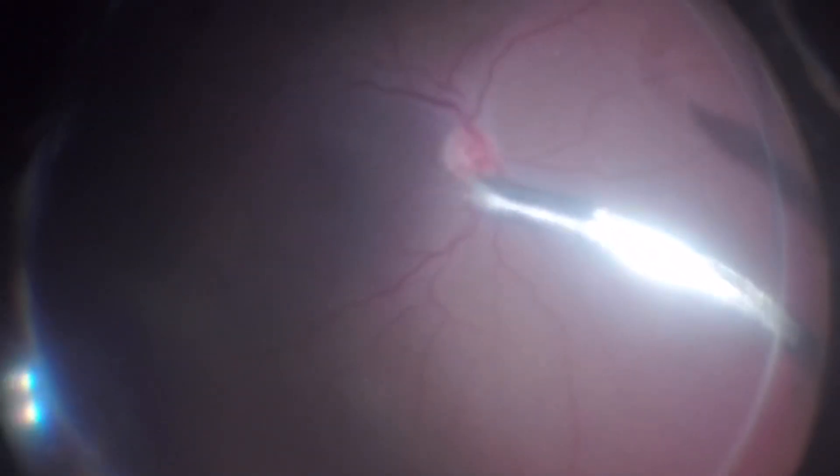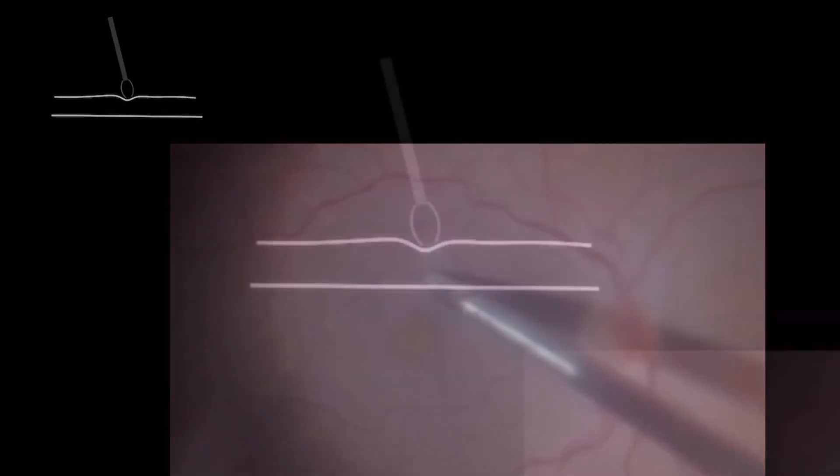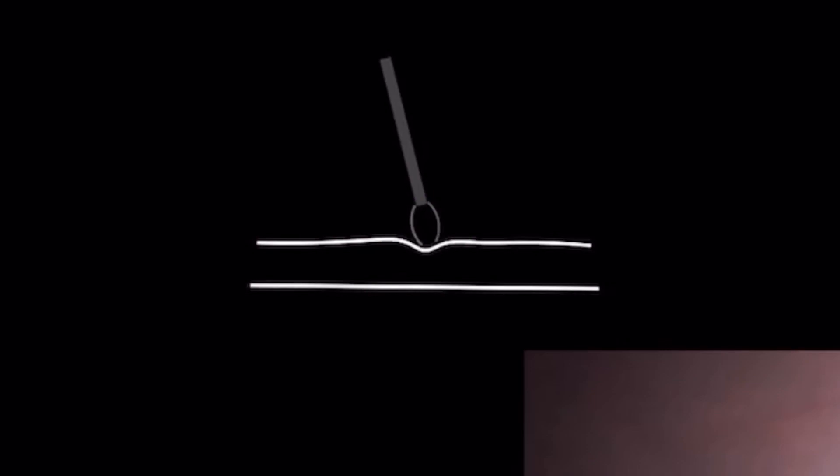First of all, it's important to pay attention to your forceps tip and respect the correct position to ensure that both tines touch the ILM simultaneously. Don't try to grab the ILM and make a circumferential rhexis at the same time. The open jaws of the ILM forceps should be placed on the surface of the retina, pushing enough to identify the surface.